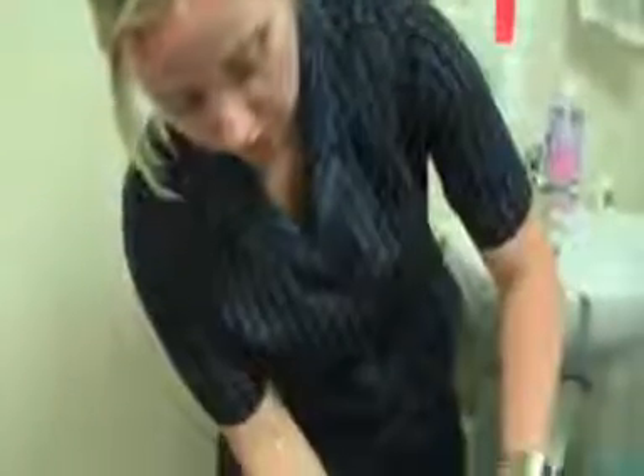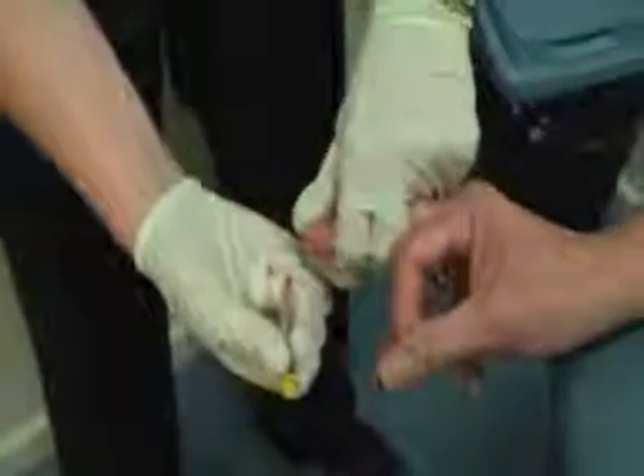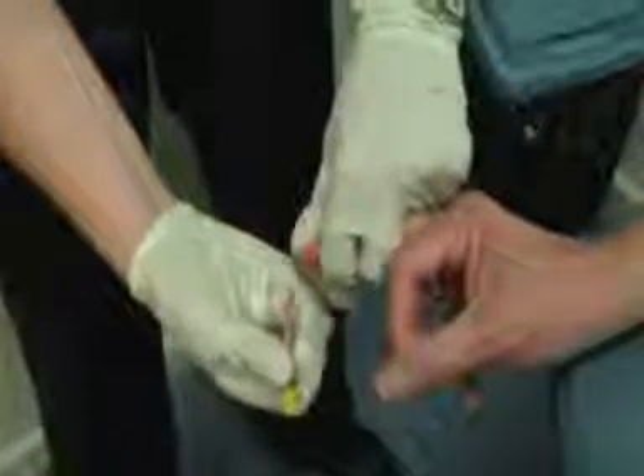It's really important that you don't try and rush this procedure. You have to let the capillary fill and then squeeze. If you just continually squeeze the finger, you'll restrict the blood flow and you won't get any blood.